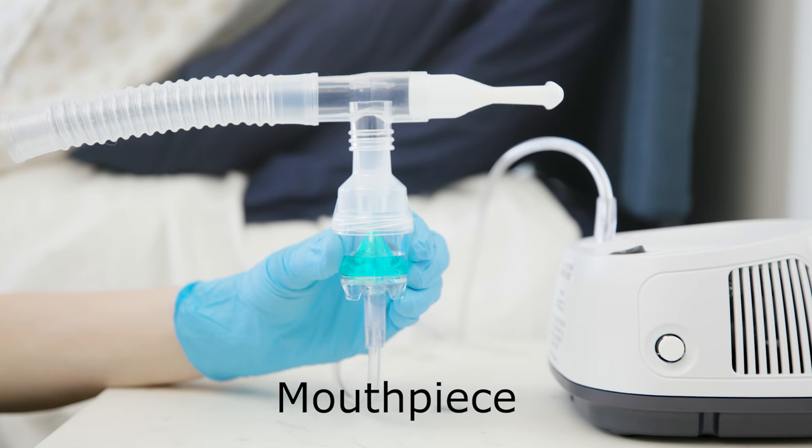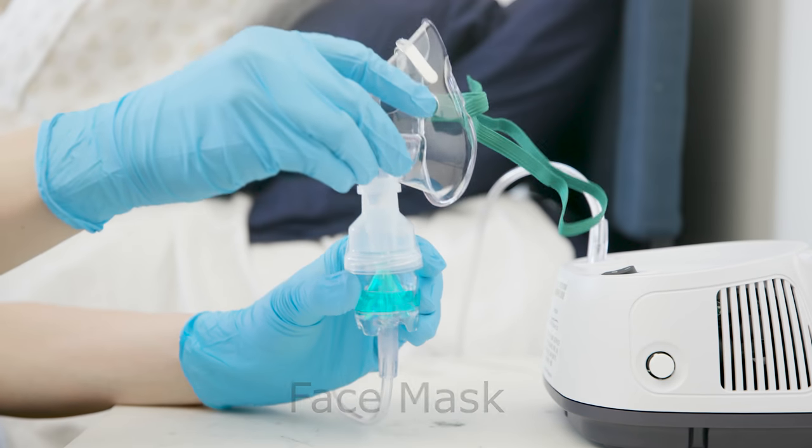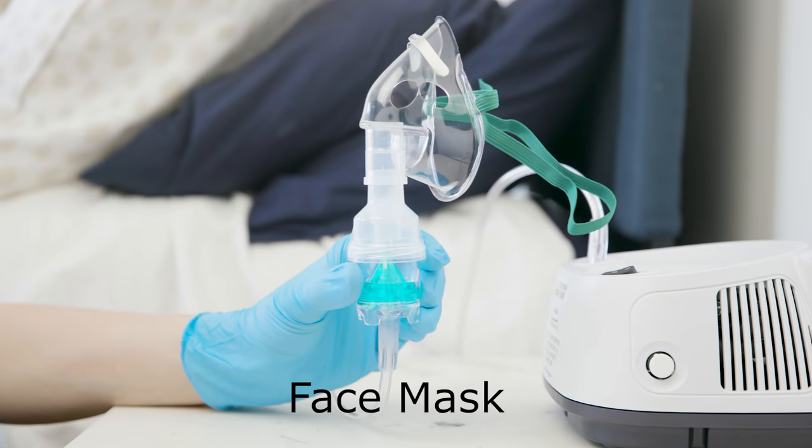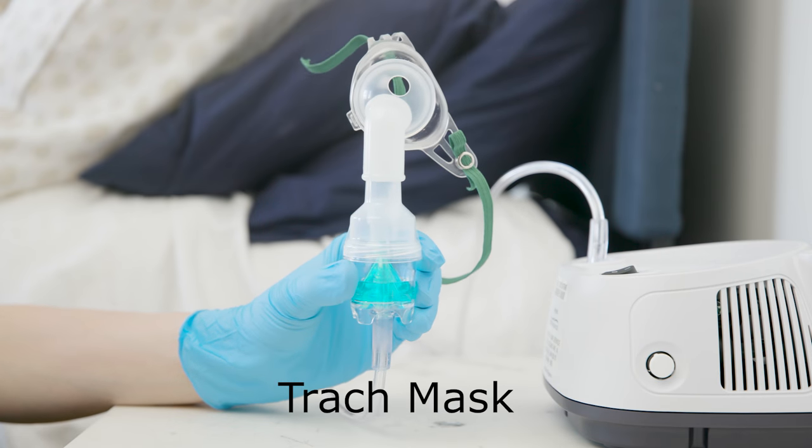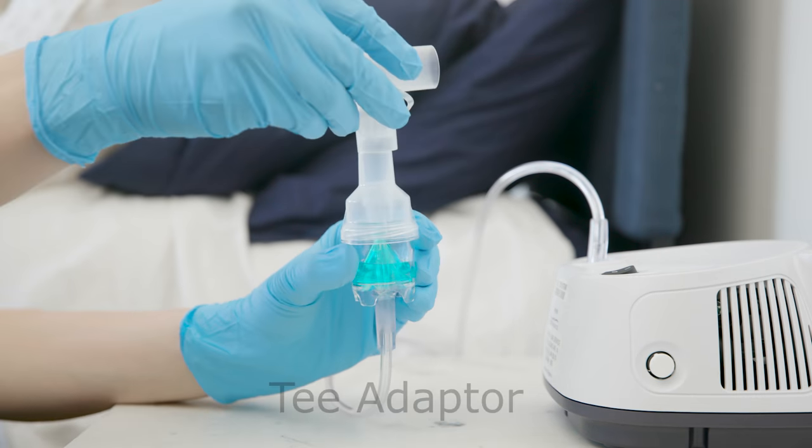This could be a mouthpiece, face mask, trach mask, or T adapter.